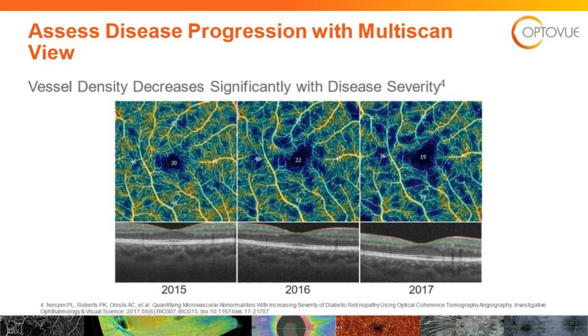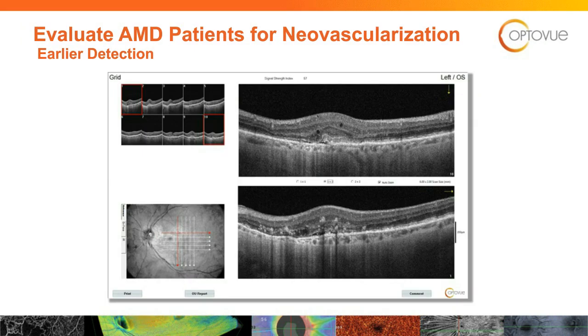We're able to evaluate macular degeneration. This one here probably didn't need angiography in a sense, but it just kind of shows it off. If you're really good at interpreting B scans, you could see that in this picture on the left eye, on the upper image, there's a little hyperreflective area right where that macula is. That gives a higher suspicion that there's a choroidal neovascular membrane.